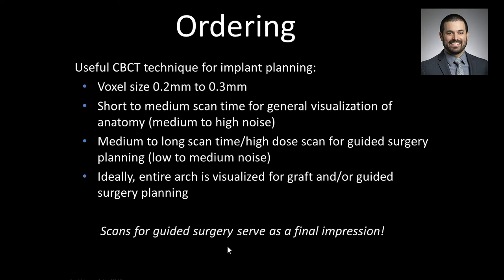The last point I have here, and we'll come back and revisit this point, is if you are doing guided surgery, that scan leaves this realm of diagnostic visual information only for your brain and becomes essentially a virtual final impression, or if you will, a virtual articulator. And so they're diagnostically two very different things. So you have to really treat all that data as a final impression, as a virtual articulator setup, with all the attention to detail, step by step. We'll come back and revisit that discussion later on this evening.